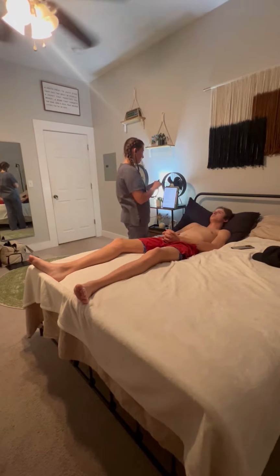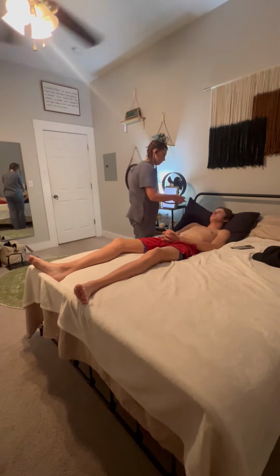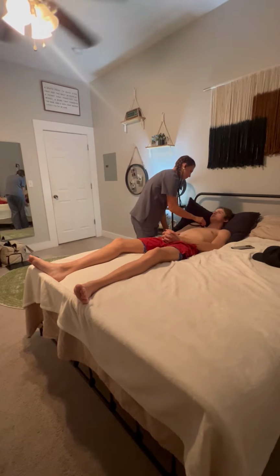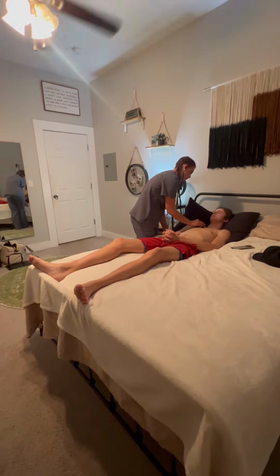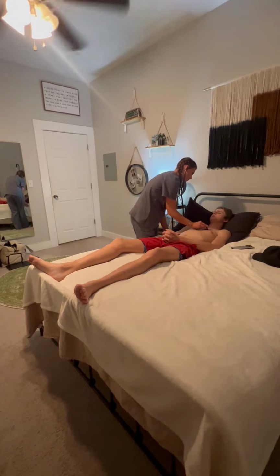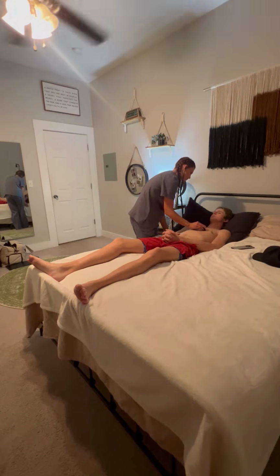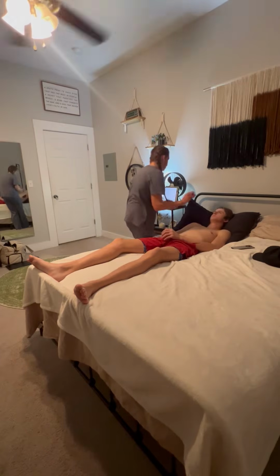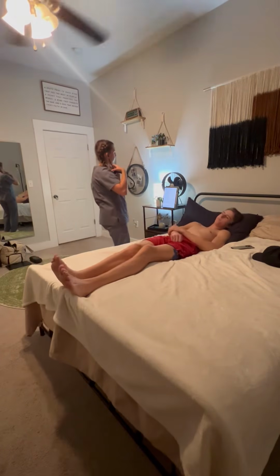I'm going to flip it over to my bell now to check for any murmurs, and I'm just going to go on those same 5 spots. All right, all of those sounded good as well.